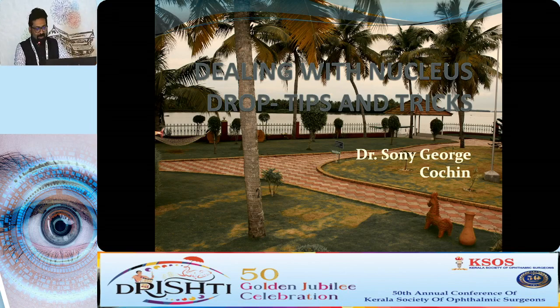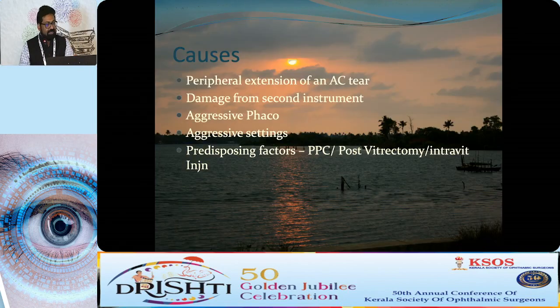Enough cataract surgeries, that's all. At some point in time, you will have at least a fragment drop once you cross a significant number. And obviously, at any stage in life, it is going to be a nightmare for you. And what could be the causes?